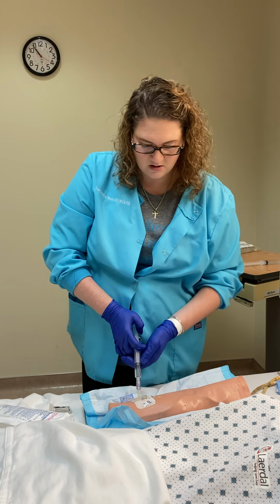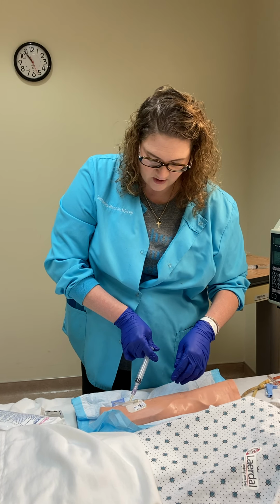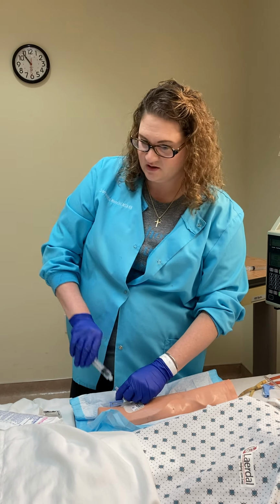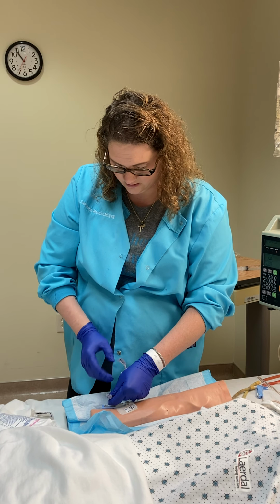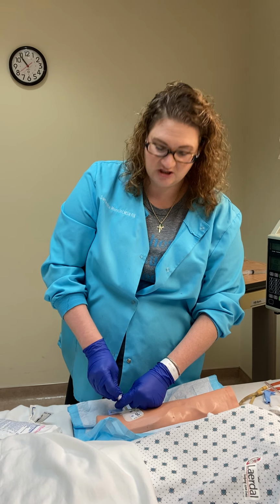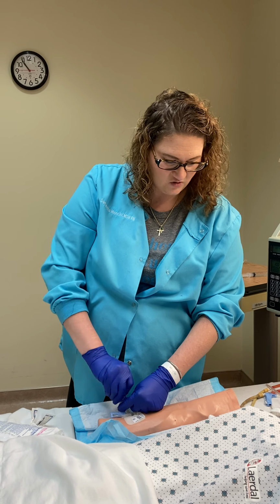Okay. Aspirate for blood return and I flush. He denies any complaints of pain. We're good there. Going to take a second swab. This I will put in sharps when I'm done. And I'm going to scrub again. We scrub in between each time that we would reconnect a syringe or attach the line. So another 15-second scrub.